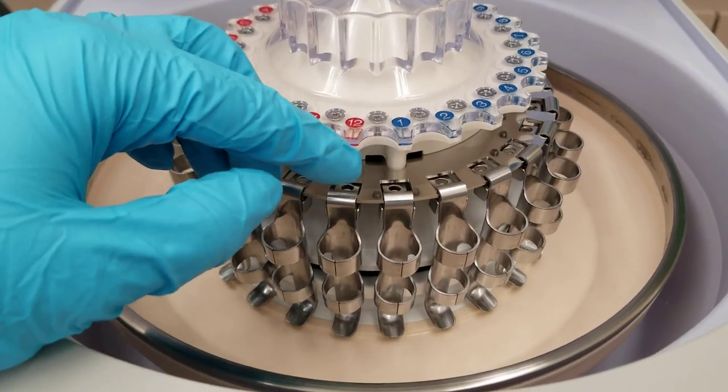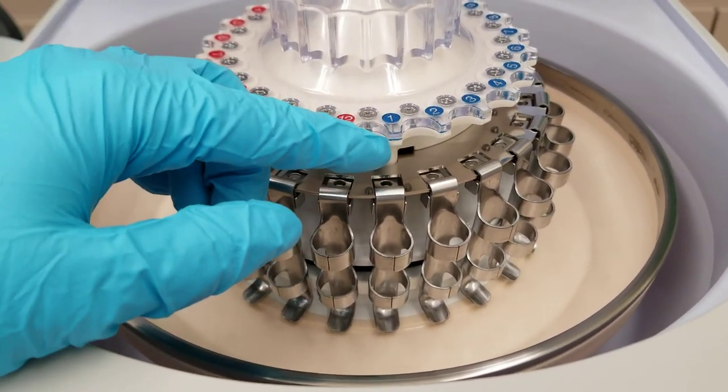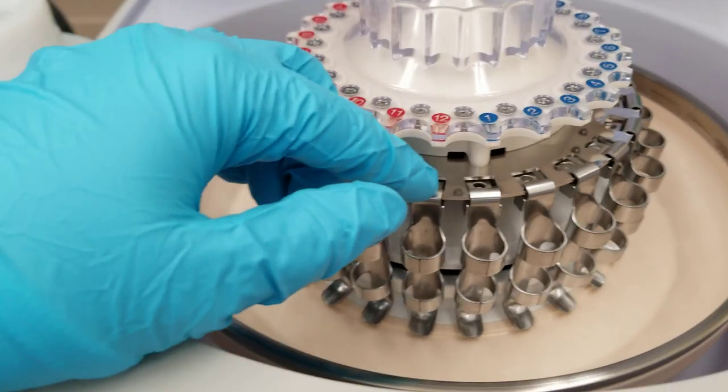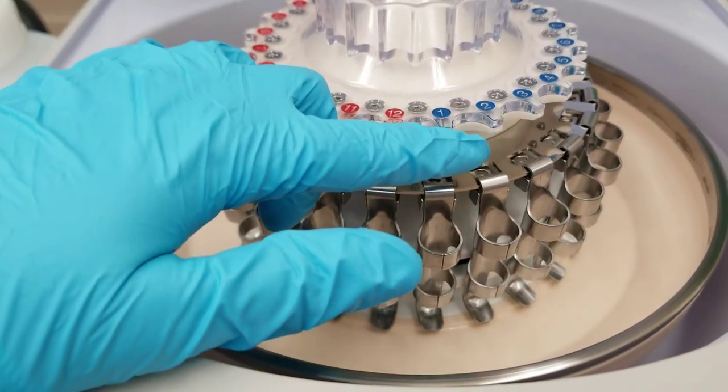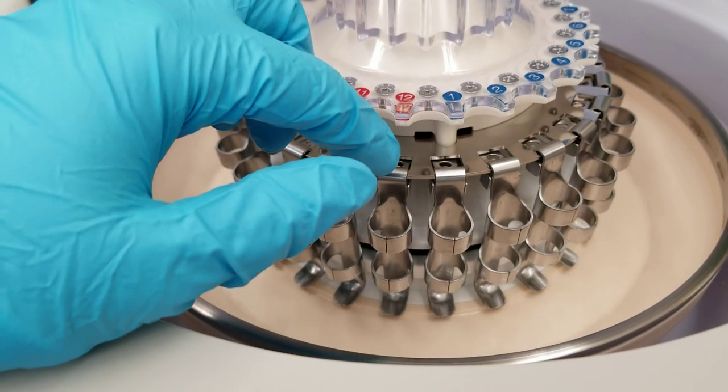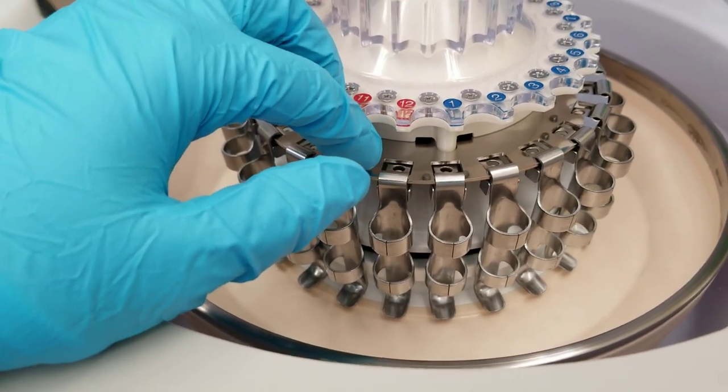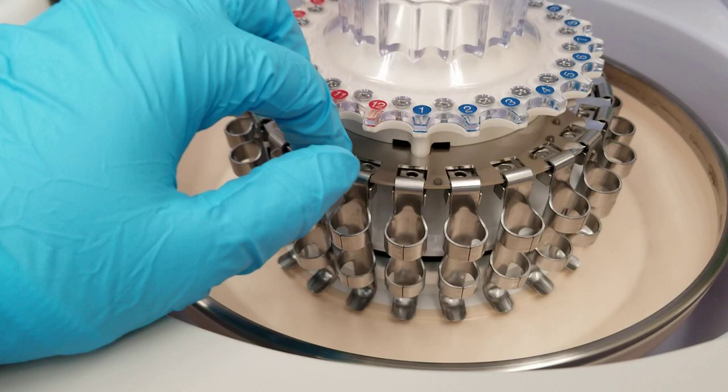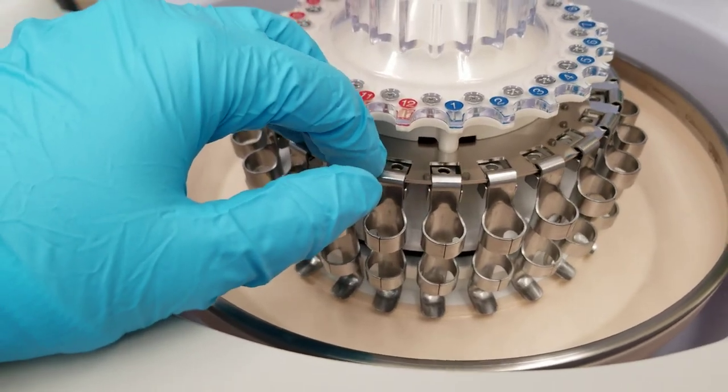So you'll notice that we've got 12 next to a one. Well, each side is color coded. So we have one side that's red, one side that's blue, and they both count all the way up to 12. And so you can color code to show whose specimen is whose or however it is that you want to do that.